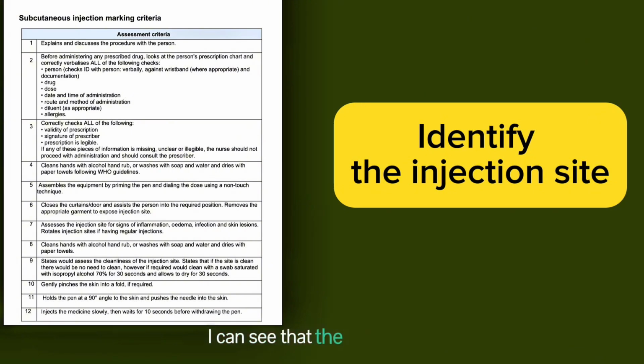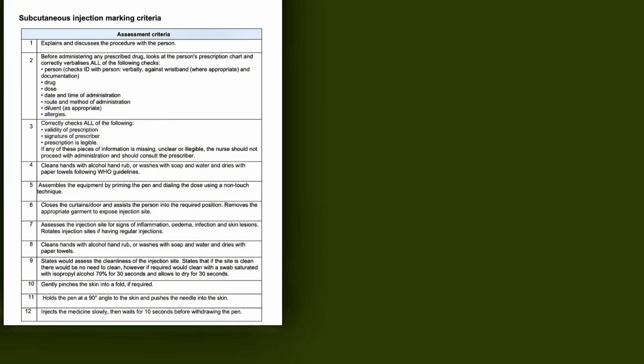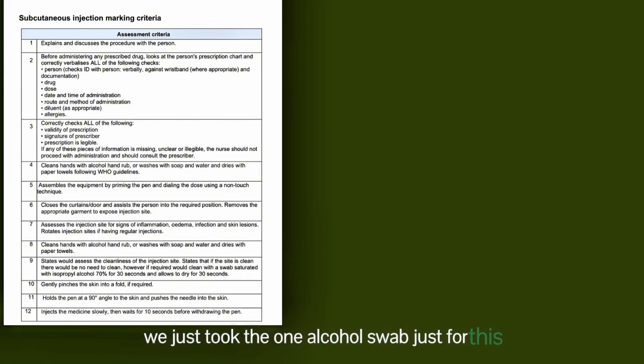I can see that the site is clean, so there is no need for me to clean it. If required, please clean with the alcohol swab. Let it dry for 30 seconds. Just as a reminder, while we were preparing the articles, we took just one alcohol swab for this.